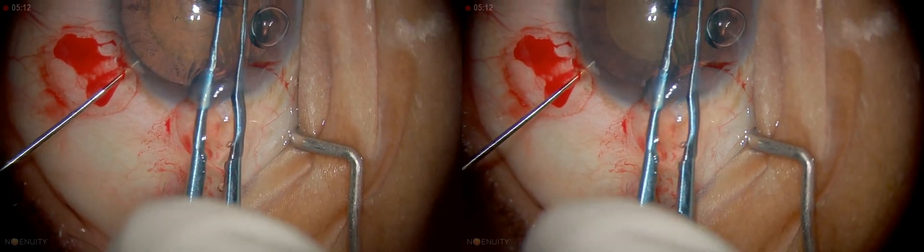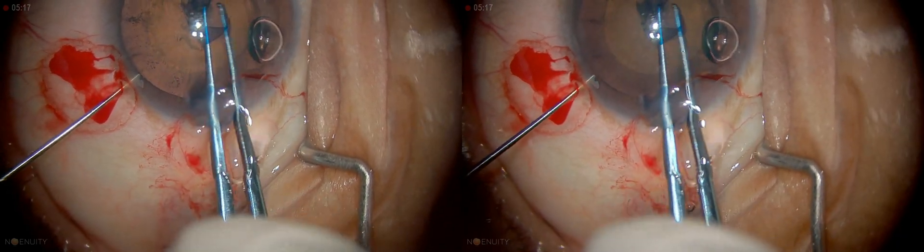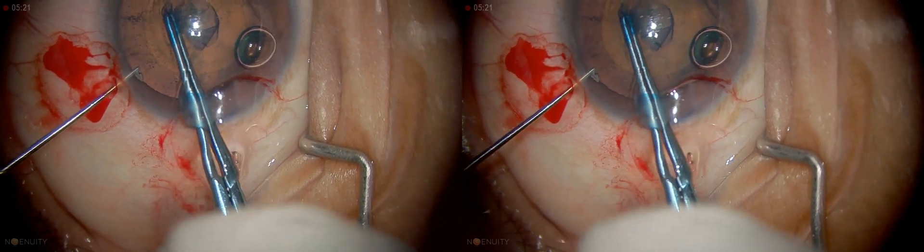Pick it up again and make sure the anterior chamber is deep. If the anterior chamber depth is reduced for any reason, you need to go in and deepen it before proceeding with the rhexis. Otherwise there is a risk of runoff.